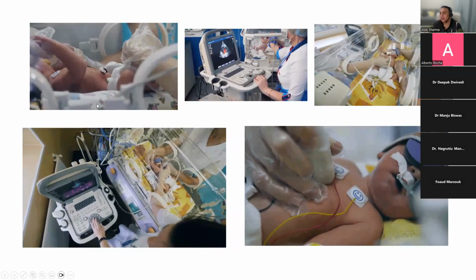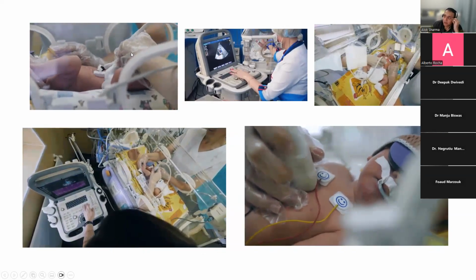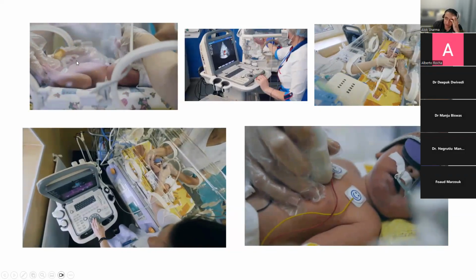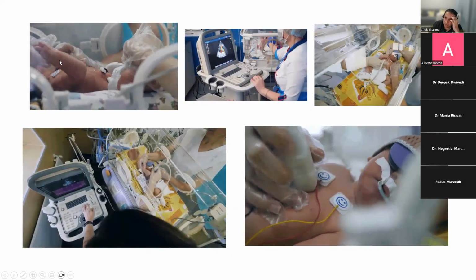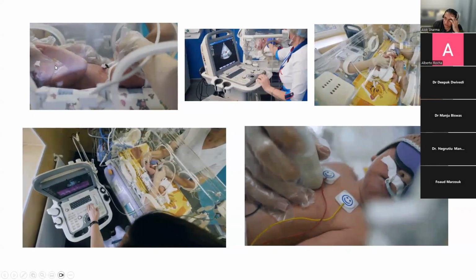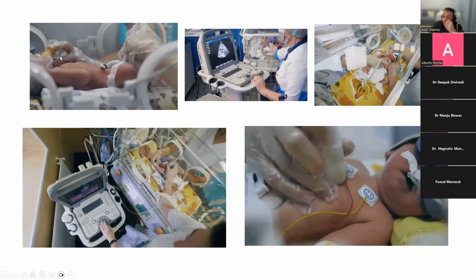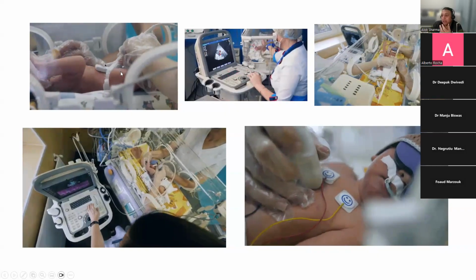These are really good examples of how containment helps. If you look at this baby over here, this is basically an abdominal ultrasound. He's really uncomfortable, and unless containment is being done properly, it's not really helping, because we're trying to get him to suck on something. I think what this baby really might need is some sucrose if you can give it to him. But a lot of pressure is being applied, which is obviously painful.